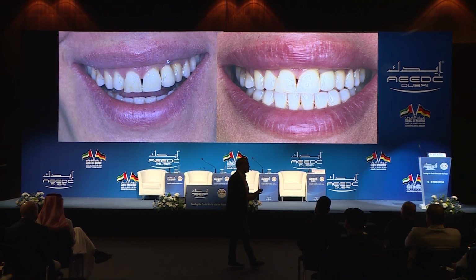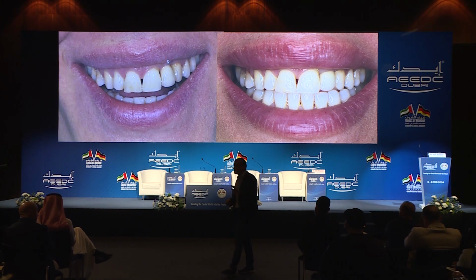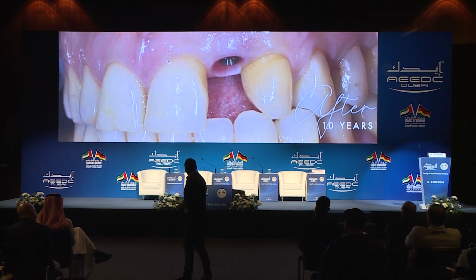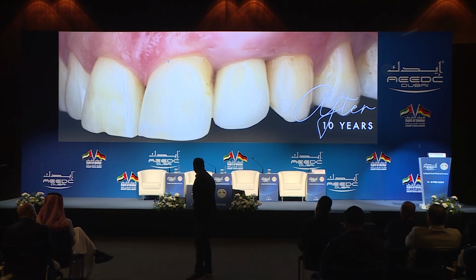The other good news, Raquel, she started doing lip filler, which was really amazing. I love it. I do lip filler too, not because I like lips, just to hide my complications or hide the missing papillae. So this is something that you should learn too. Sometimes it helps, Botox and filler for dentists. So this is the case how we started, and this is the case 10 years post-op.